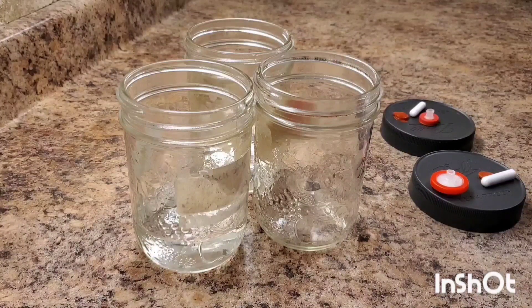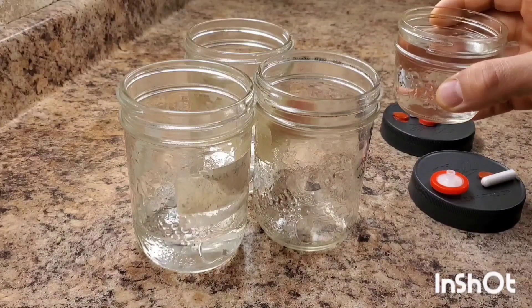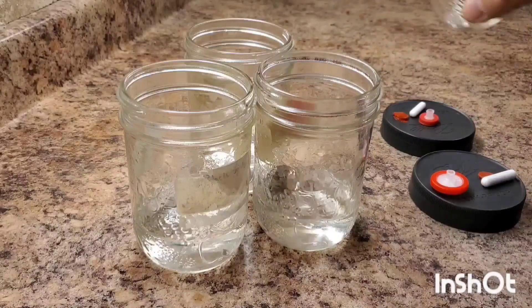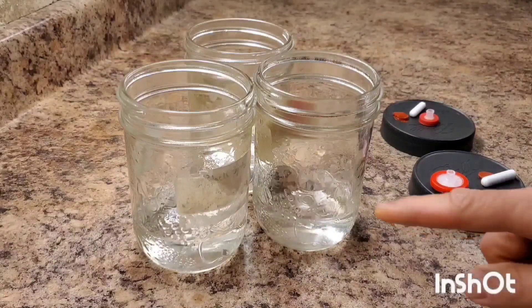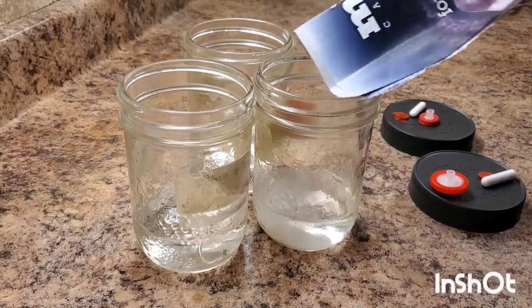We're going to use about 100 milliliters of water, which I have right here. 100 milliliters is also 100 grams of water, so I've weighed out 100 grams. You can use a lot more and fill the jar about halfway, but I'm just going to do a little bit today. Then I've weighed out one gram of malt extract and three grams of dextrose and I'm going to add that to our jar.